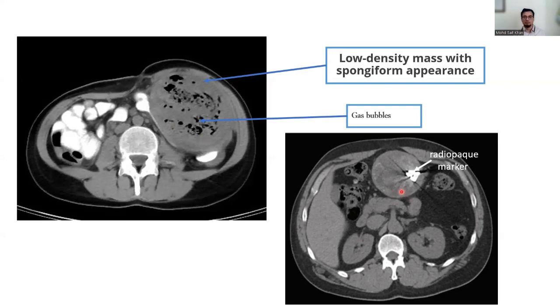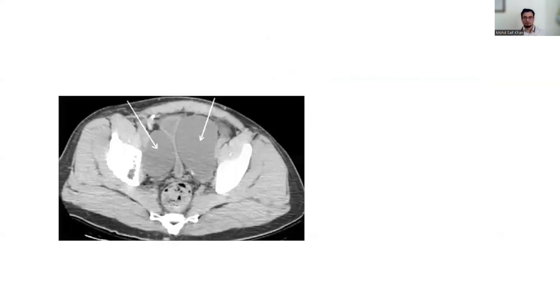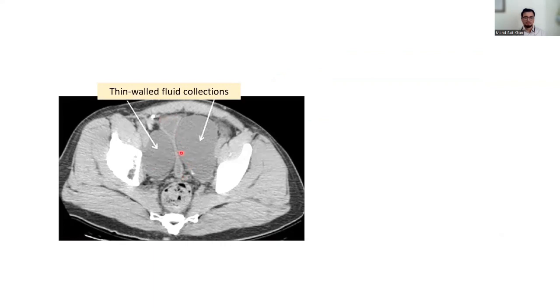A CT pelvis shows two fluid-filled cystic structures compressing the bladder in between, giving it an hourglass appearance. This CT was performed post-operatively after robot-assisted laparoscopic radical prostatectomy, complicated by pelvic lymphoceles — these fluid structures are pelvic lymphoceles.